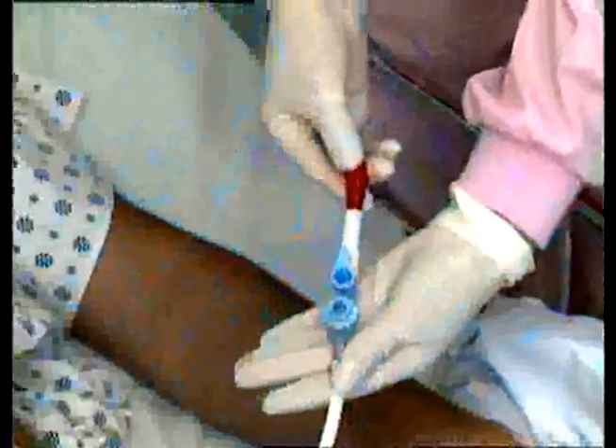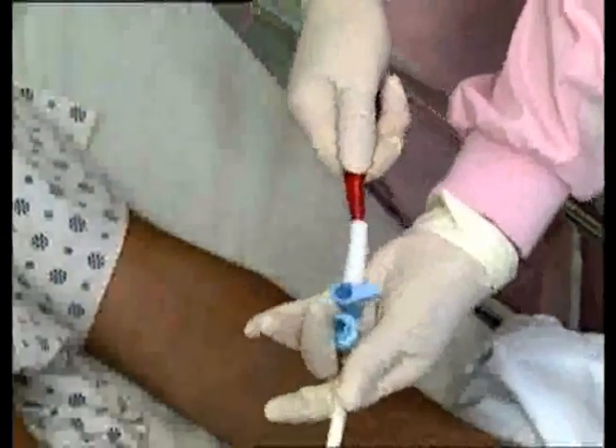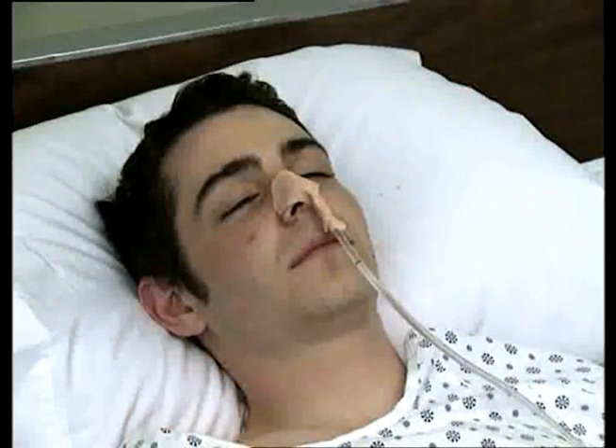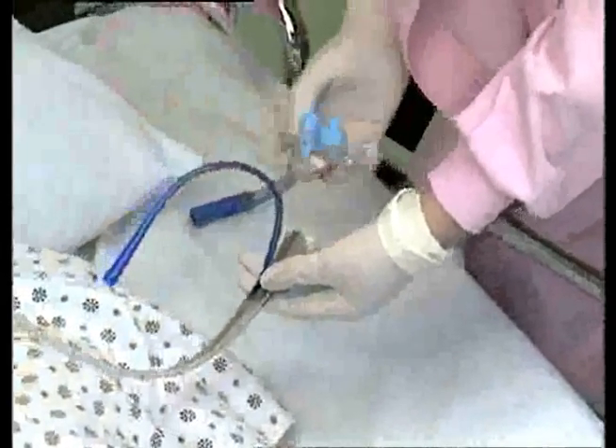When feeding is completed, turn the handle to the off position and remove the feeding set from the white flexible adapter. When the ACE Connector is used for NG feeding, attach the NG tube directly to the catheter connector.